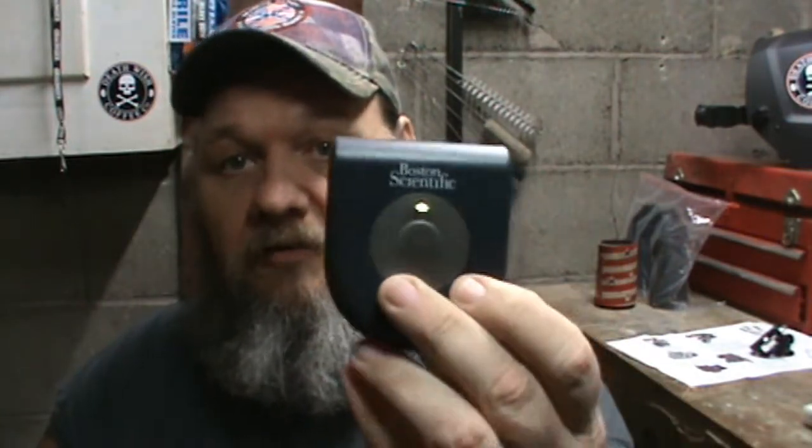And you're gonna get a belt. It's a belt, it's Velcro. If you're a person of my size, they're gonna give you an extension with it too, an extender belt. And what you do is this belt's got a little pouch right here. And what you do is you turn on your charger, and it makes a beep sound, continuous, until you find your generator. I'll simulate it. Say I just found my generator, that beep will automatically stop.